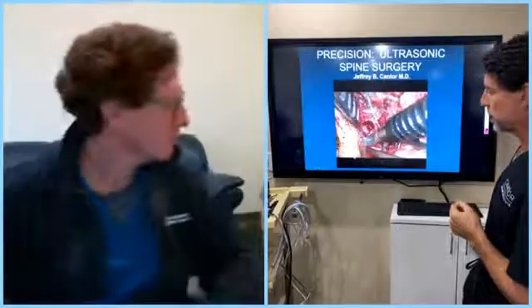Well, actually, I don't have something like that loaded. What we would normally have is a CAT scan, and the CAT scan can give us accurate measurements of where we're going to cut. I don't have that loaded on the program right now. I can load one, but it'll take me a few minutes. I do have some examples of different types of surgery that we do. I can go over a couple neck operations and some lumbar surgeries and really show the difference in how this changes the whole paradigm.